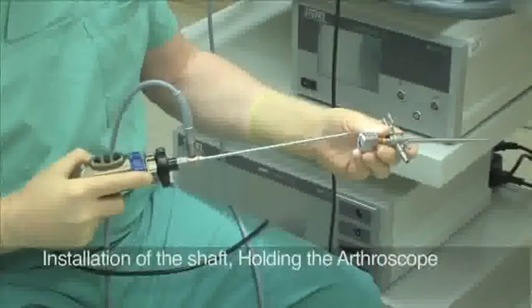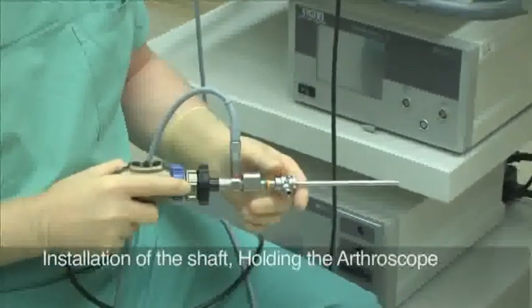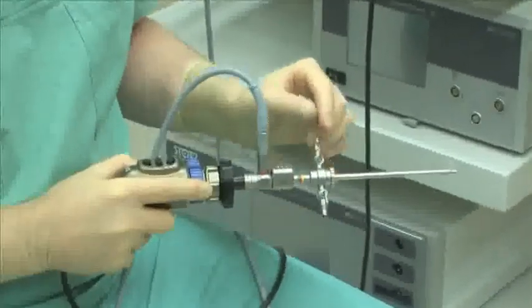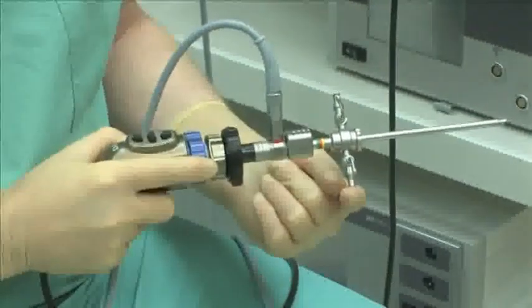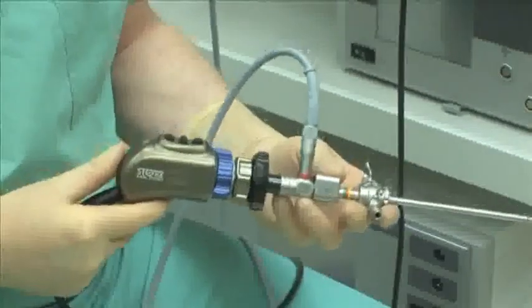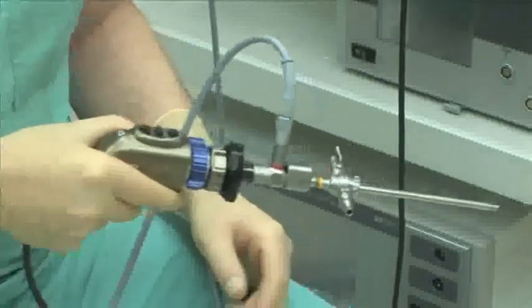During arthroscopy, the endoscope is inserted into a sheath and coupled to it by pressing until a click is heard. An irrigation and suction tube is connected to the rotatable stopcock. The whole system can be held by the camera, resulting in an extremely long lever that makes movements less controllable.